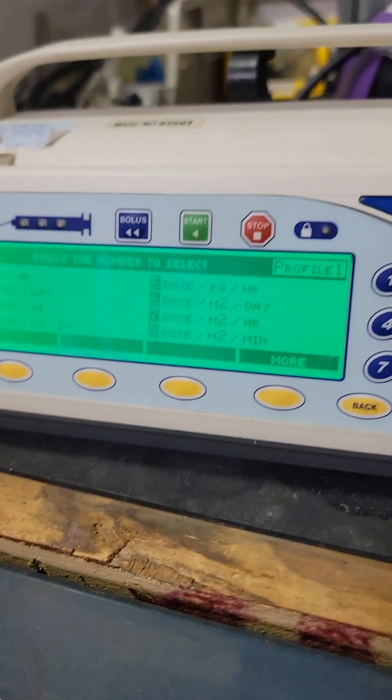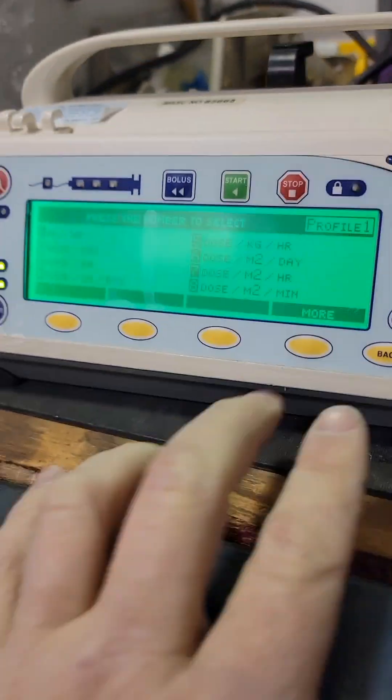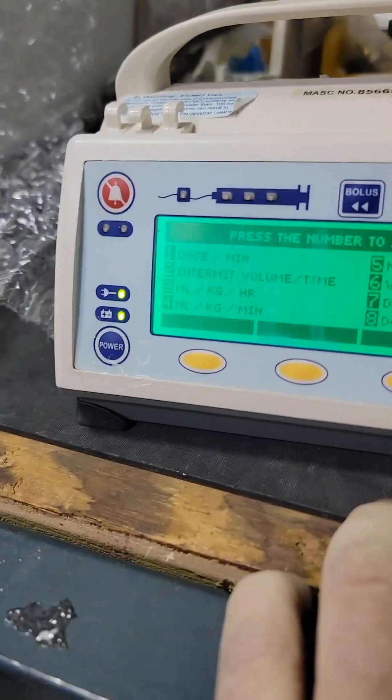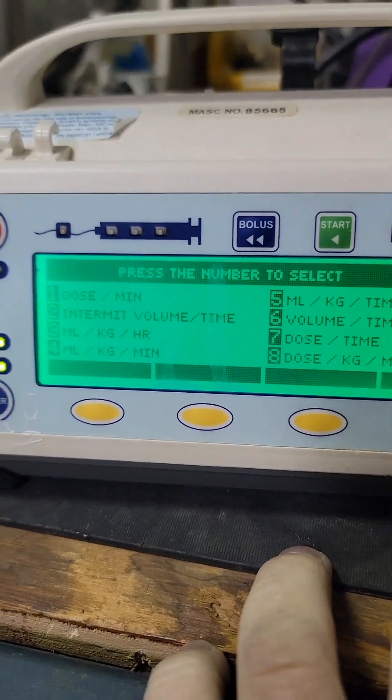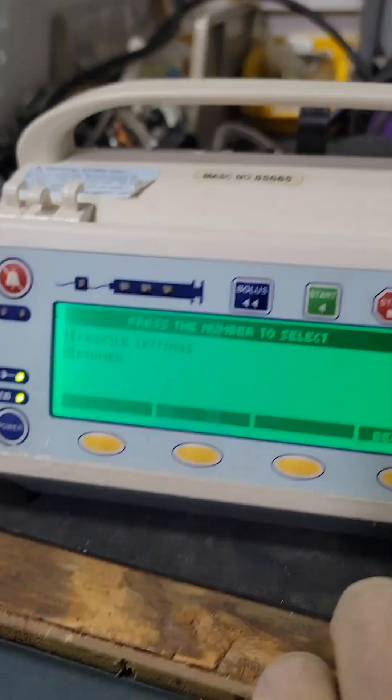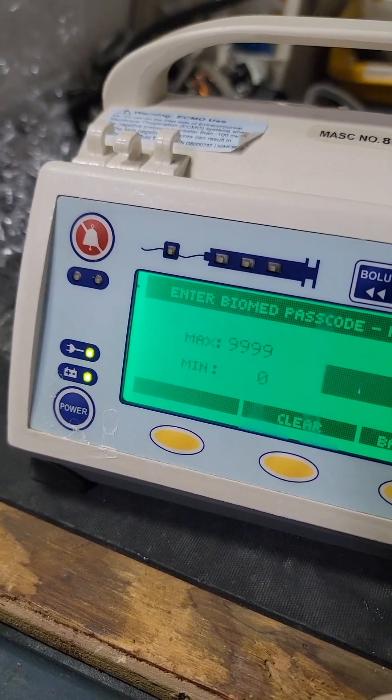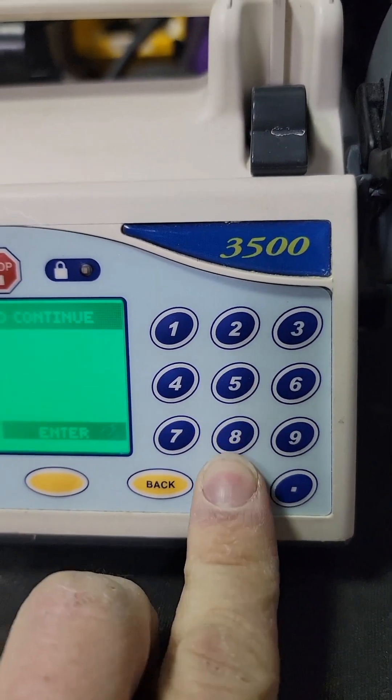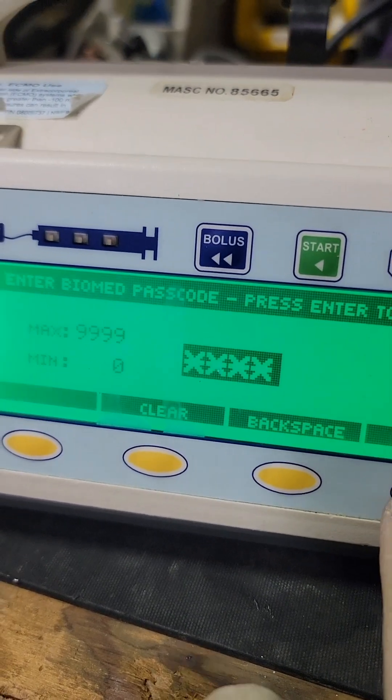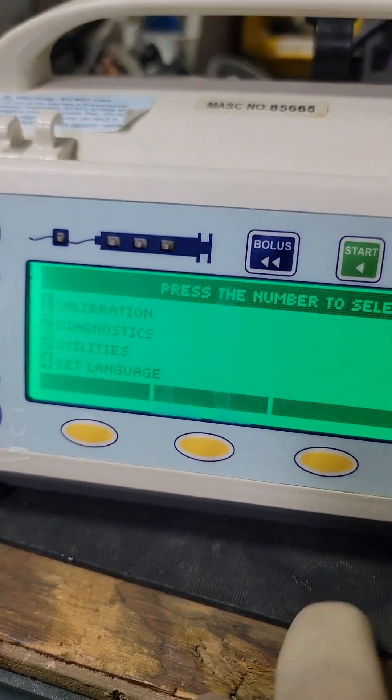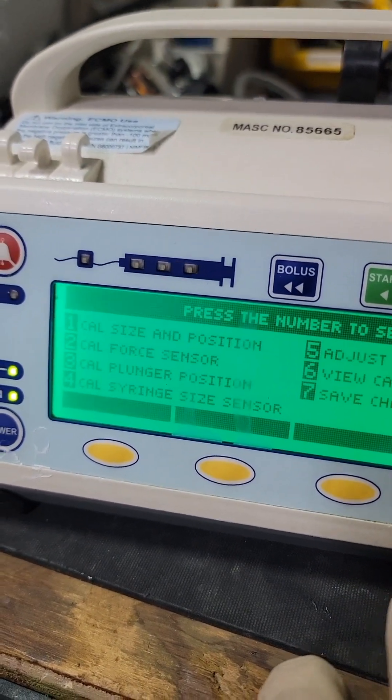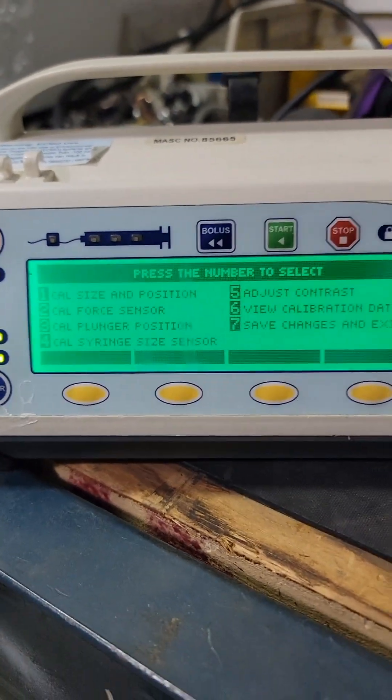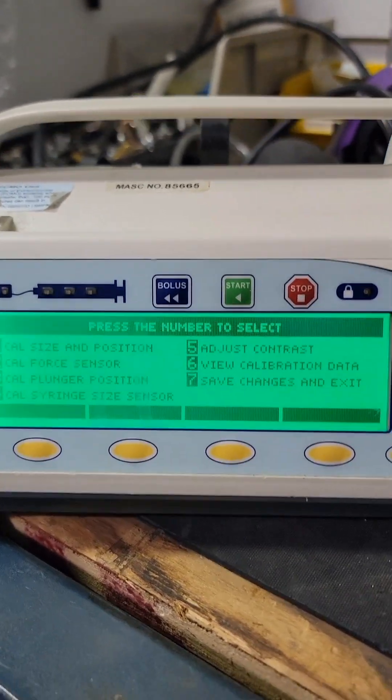There's a normal screen, your screen may look different depending on what software you've got and what settings you have. Press 'more' and 'more' so you get this screen. Enter the biomed password, it's nice and easy right down the middle: 2-5-8-0, enter, then calibration.